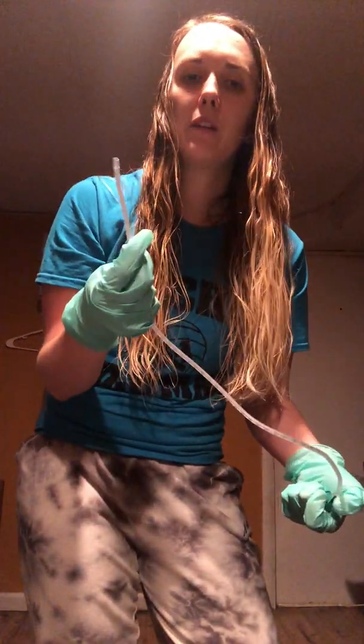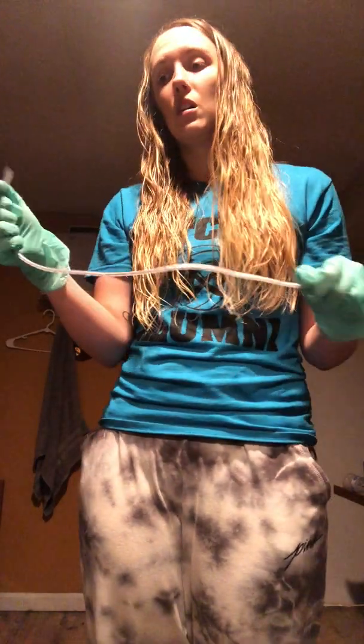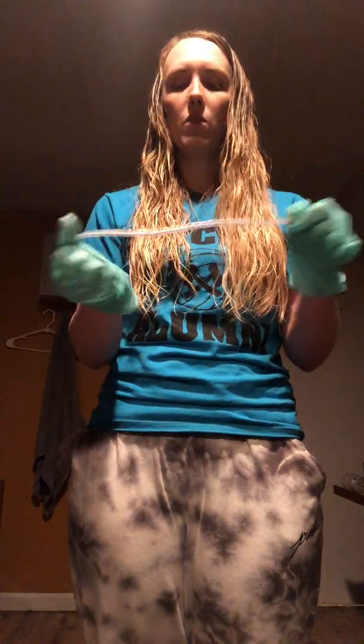Like I said, we're going to suction a little bit of our sterile water to clear this tubing up and lubricate it a little bit better. Then we're going to insert, insert, insert to where we marked. And then we're going to apply our suctioning, rotate this tubing, and remove it. Of course, once we get finished with this, we are going to coil it in the sterile hand and take our gloves off. Then we're going to get rid of it in a biohazard bag, so we're going to throw that away.